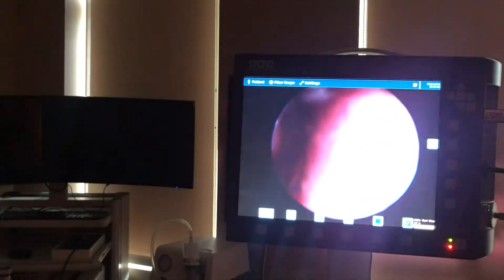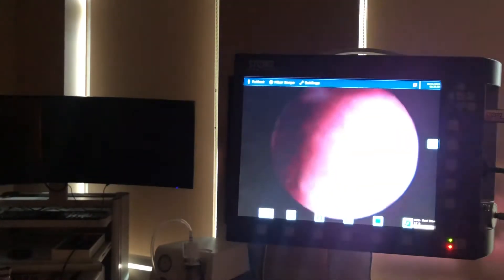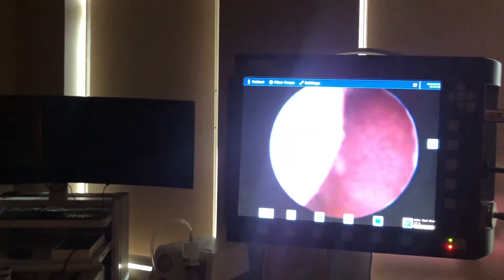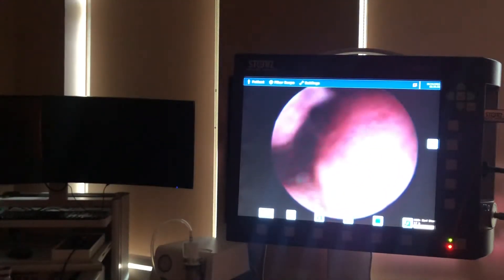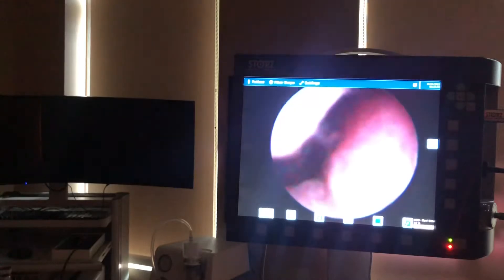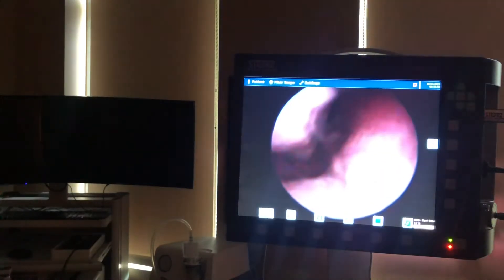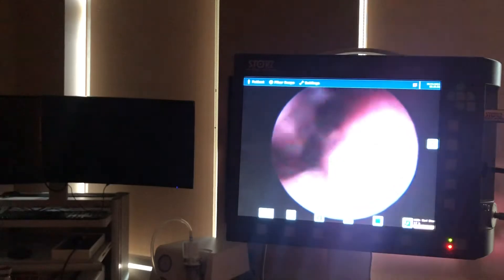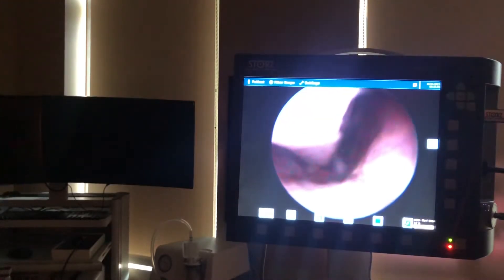I'm not doing a great job, but there's the septum and there's the turbinate right there. I'm going to kind of slide down past the area — it's all from about 9 o'clock to 11 o'clock on the screen where my inferior turbinate is.